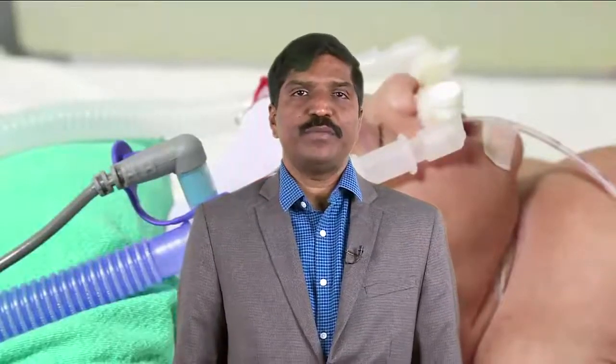If a newborn is supported on CPAP for respiratory distress, remember the rule of 5. At initiation, one may support such a newborn with a CPAP pressure of 5 centimeters, an FiO2 of 50%, and a flow of 5 liters per minute.